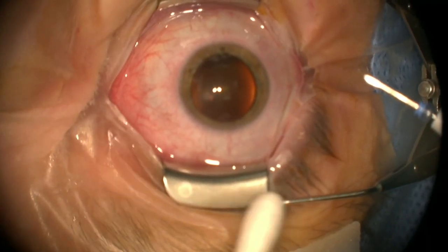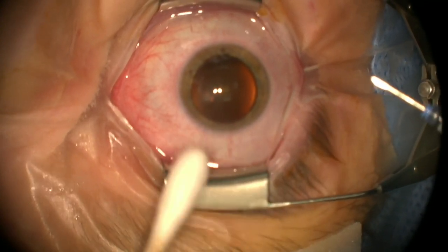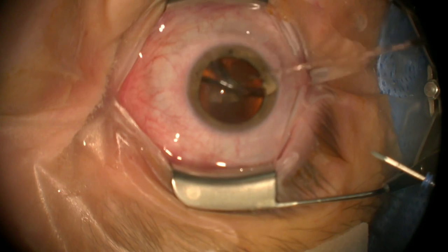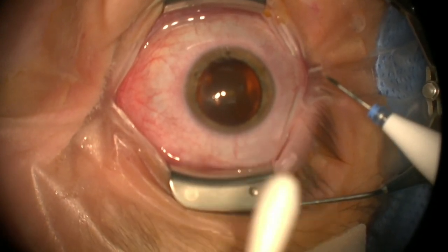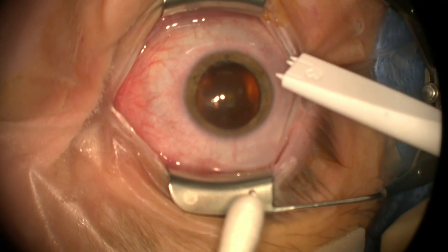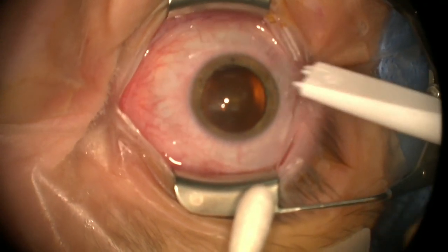A couple things in the prep and drape here. Notice how the lashes are caught behind the drape. I like to use a solid lid speculum. Also helps pull back any stray lashes. I don't like lashes on the field if at all possible. We do not cut them. I like to keep the cornea wet. We'll use a Q-tip or forceps to displace the conjunctiva slightly. I don't always measure, but I will today at the 3.5 mark.